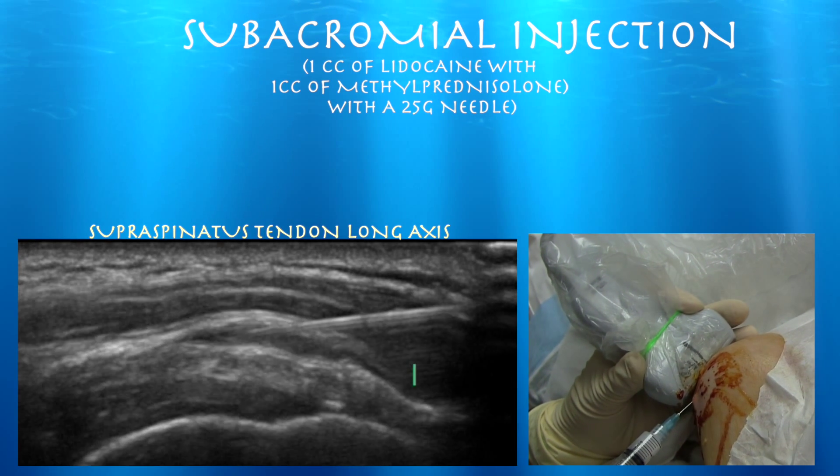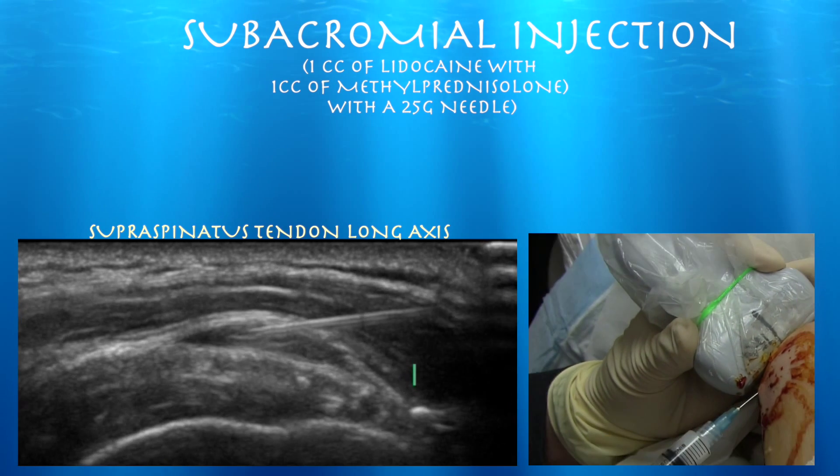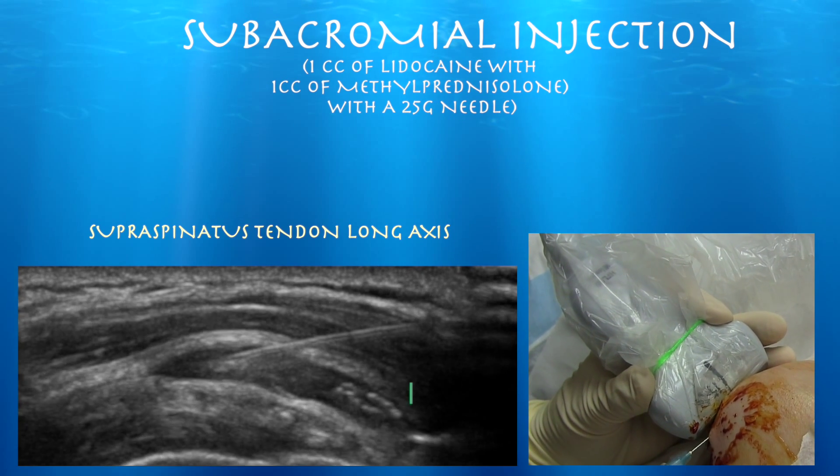You really don't have to advance proximally, but sometimes I do just to ensure that the injectate I'm administering will go proximally as well. Here you can see it spreading out nicely over the entire distal half of the supraspinatus tendon.